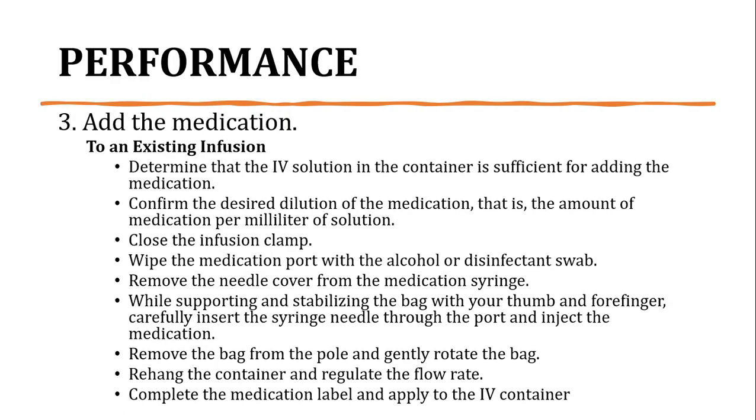Next one is adding medication to an existing infusion. Determine that the intravenous solution in the container is sufficient for adding the medication. Kailangan po sapat yung intravenous solution para dun sa lagayan na naka-connect sa client before administration of medication.